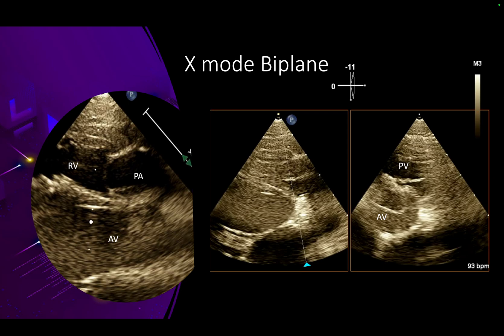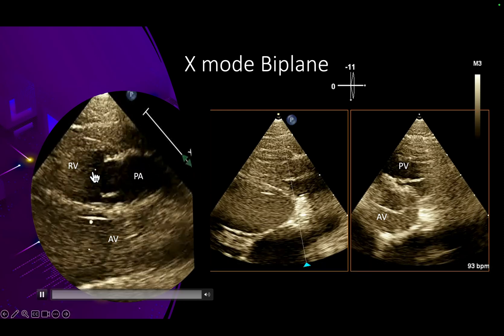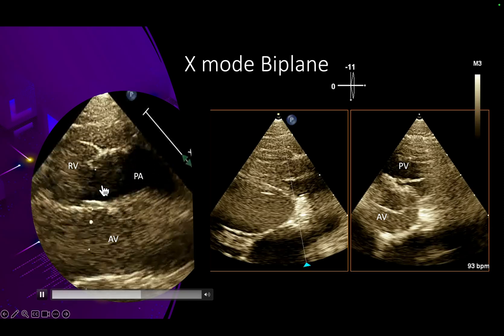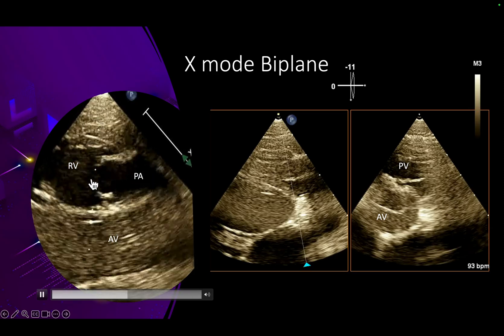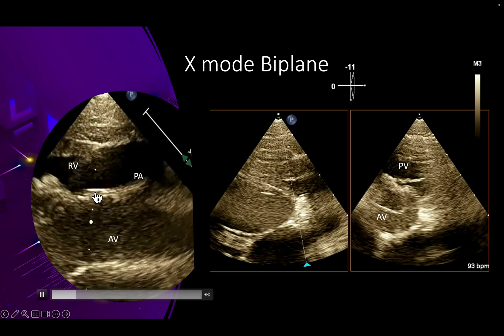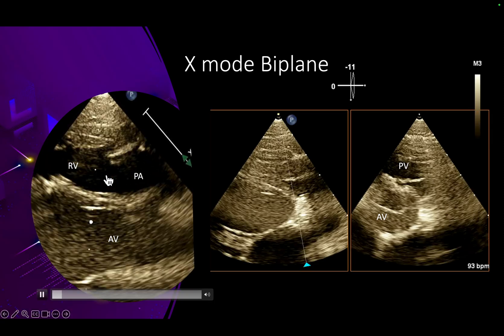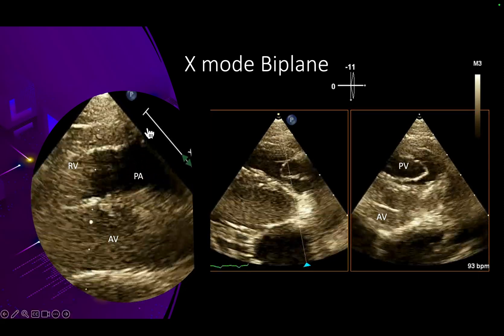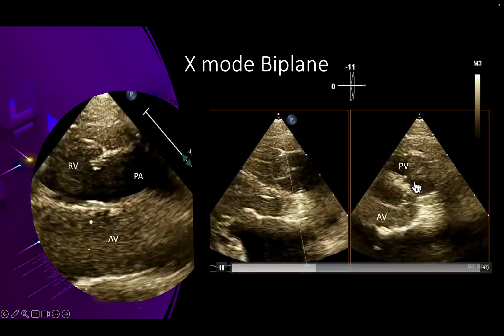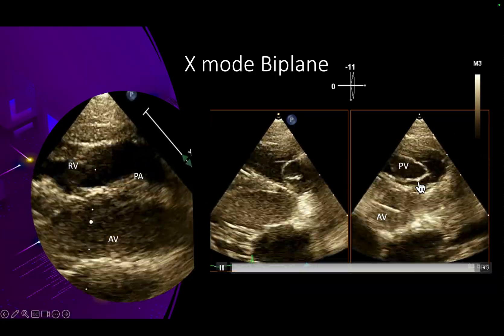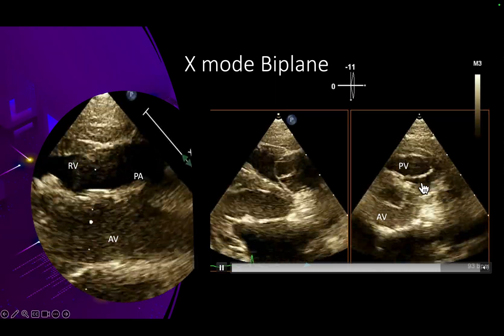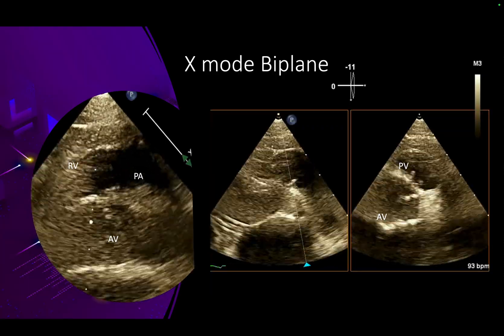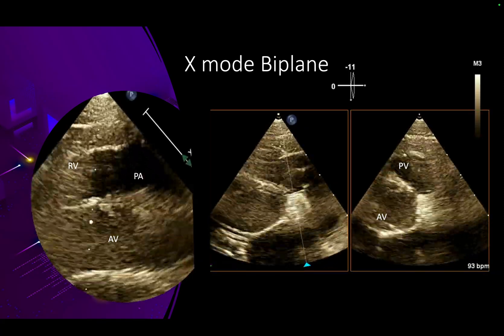In the same patient, we performed an x-plane or biplane view, acquiring an image with the pulmonary valve in the perpendicular scan line. Notice the pulmonary valve is eccentrically closing - there is a larger leaflet and a smaller leaflet. Equate this with a bicuspid aortic valve where you have eccentric closure. In the biplane view, the pulmonary valve is bicuspid: the anterior leaflet is larger and the posterior leaflet is smaller. So in a patient with dilated pulmonary artery without pulmonary stenosis, we would have called it idiopathic pulmonary artery dilatation.